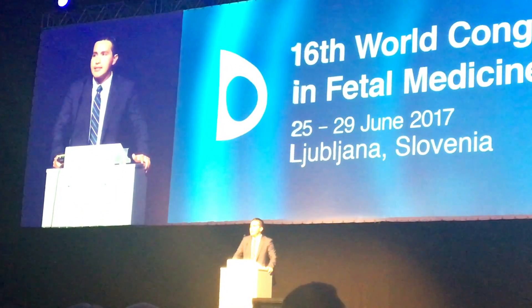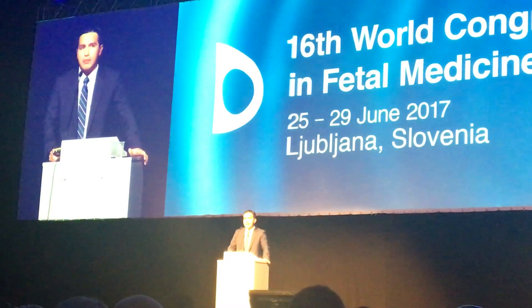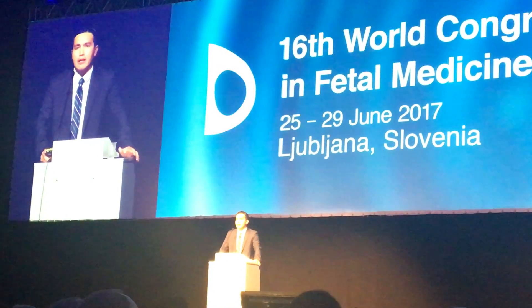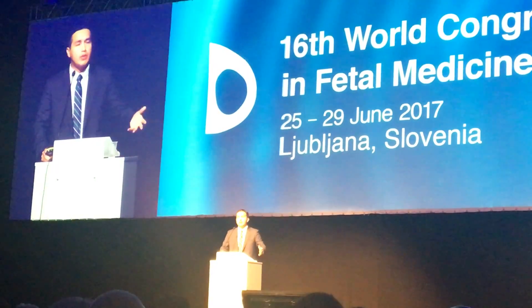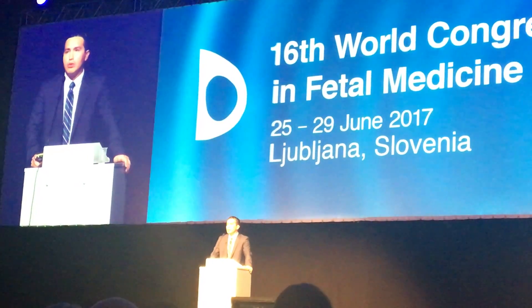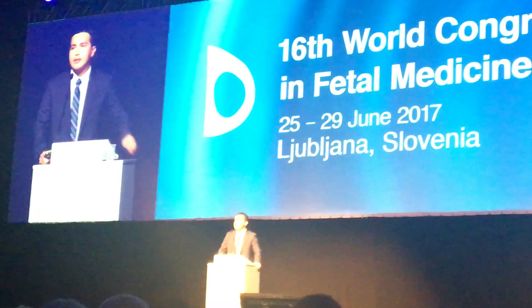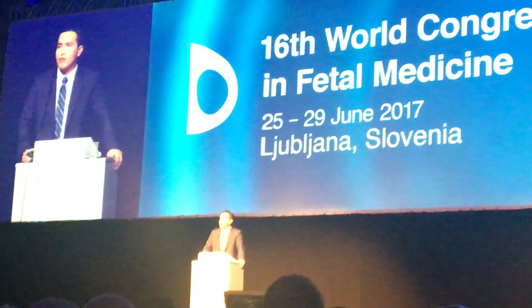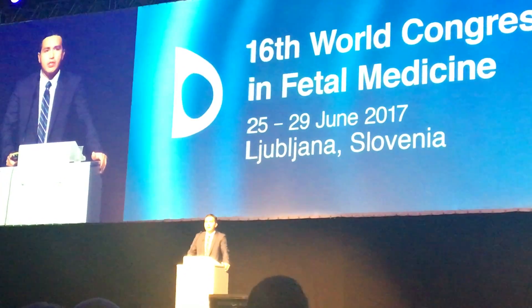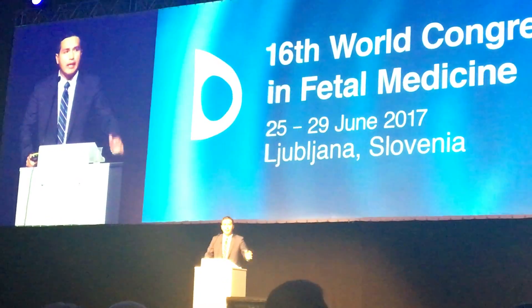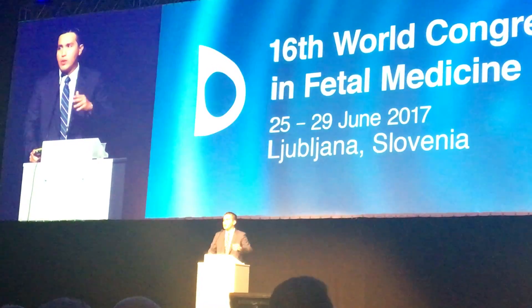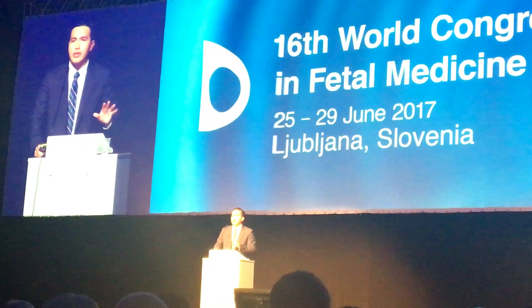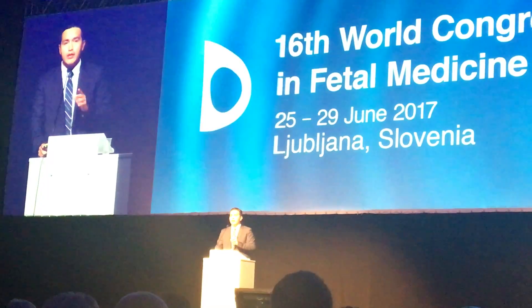In 1996, Professor Giancarlo Mari performed a study to assess fetal cerebellar circulation in normal growth human fetuses and those that were growth restricted. He measured the pulsatility index of the superior cerebellar artery and established normal values ranging from 18 weeks to 40 weeks of pregnancy. We used his approach in order to identify the superior cerebellar artery.